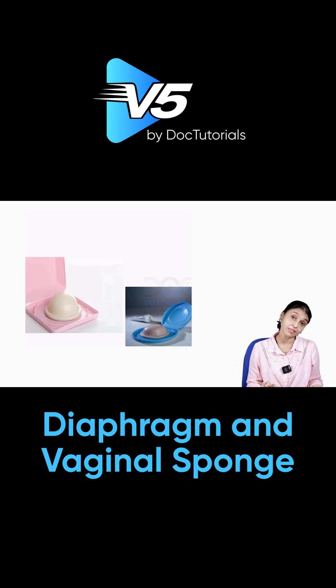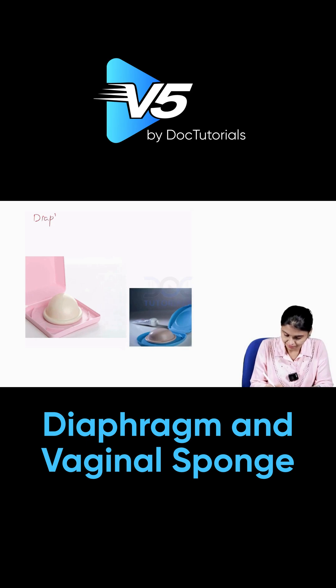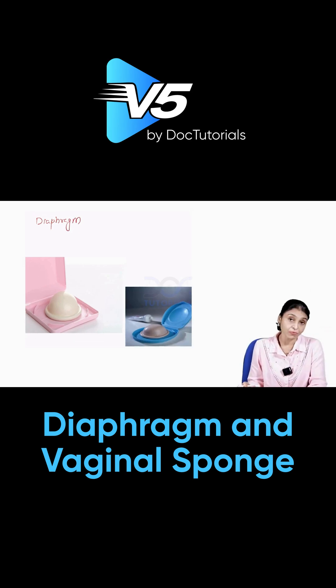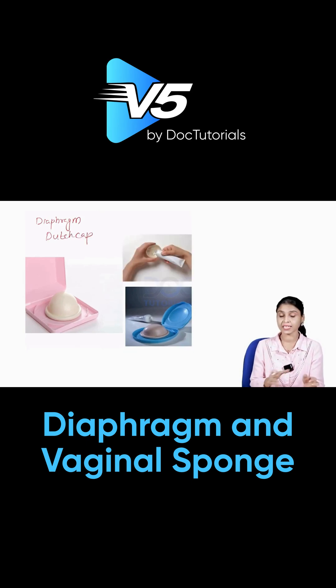Can you identify this? This is a diaphragm. It looks like the cap that soldiers used to wear, which is why it is also known — and this is an MCQ — as the Dutch cap.